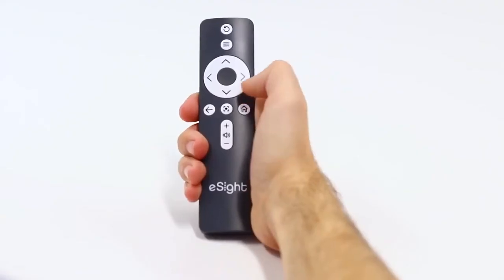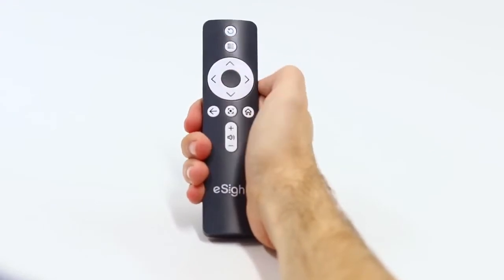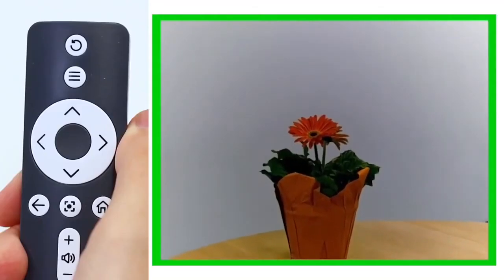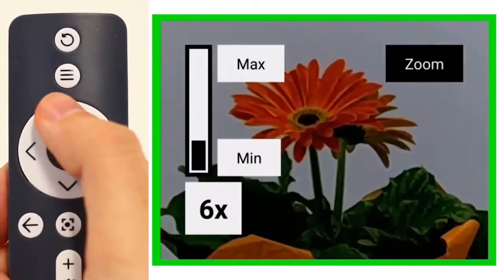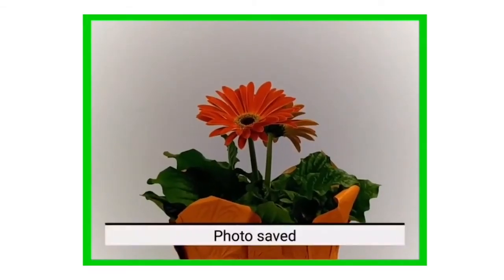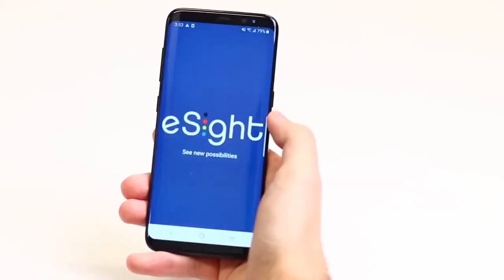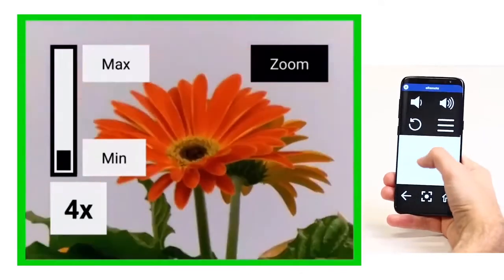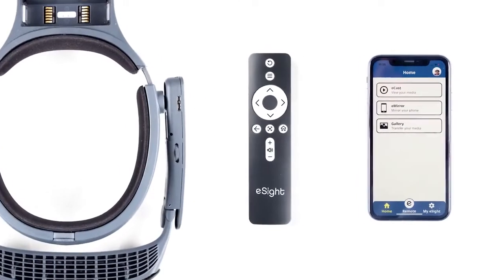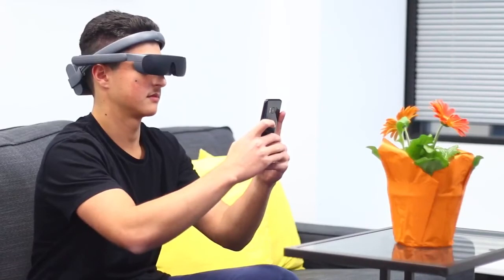They can also adjust the voice narration volume, press the reset view button — helpful for new users learning to navigate the software — and choose freeze frame to pause the camera image at any time. When an image is frozen, they can use zoom and contrast to see it in tiny detail, take a picture, or record video. They can access their photos and videos in gallery view. The third method of control is using the Android or Apple eSight mobile app, which provides access to all features demonstrated using the headset and remote control.